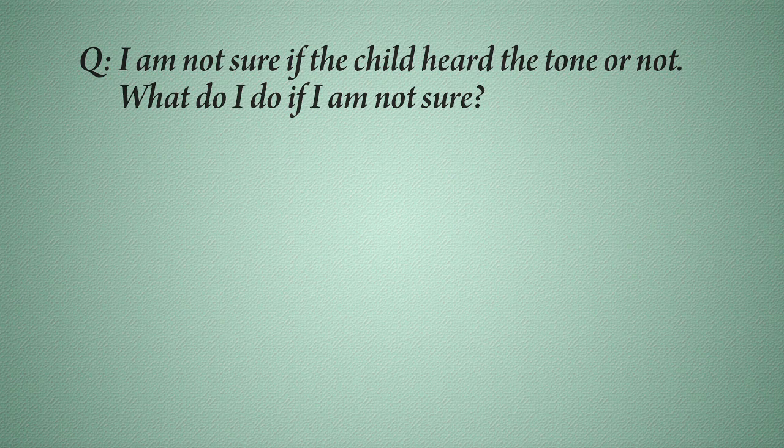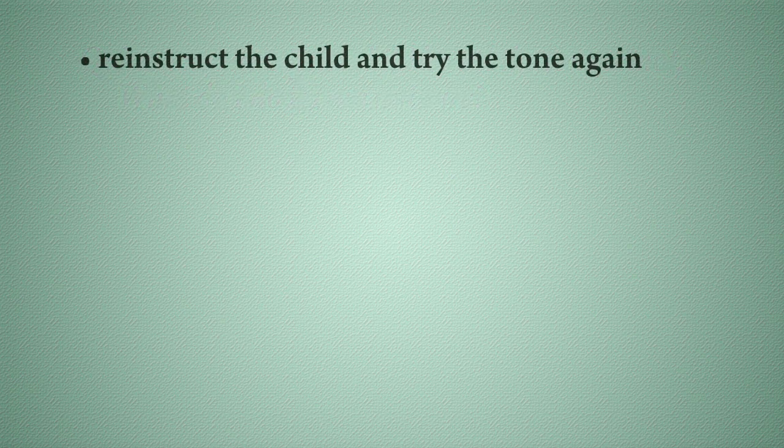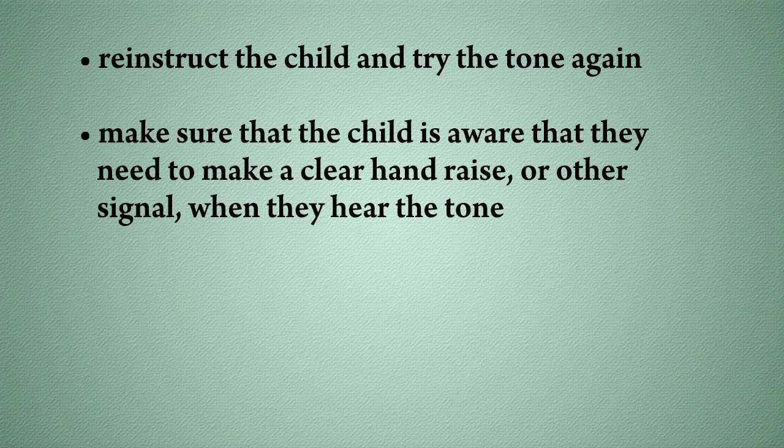I'm not sure if the child heard the tone or not. What do I do if I'm not sure? If you are not sure if the child heard the tone or not, re-instruct the child and try the tone again. Make sure the child is aware that they need to make a clear hand raise or other signal when they hear the tone.